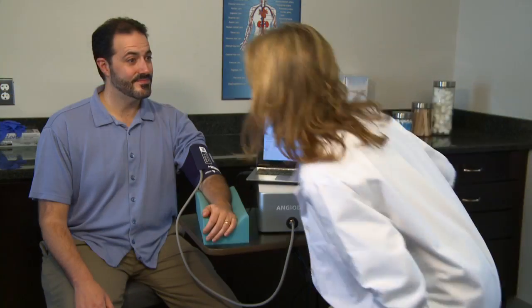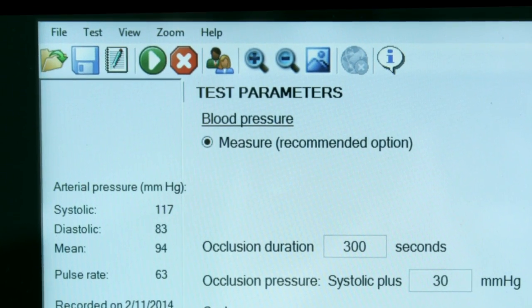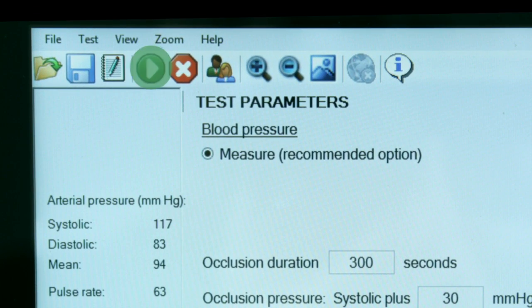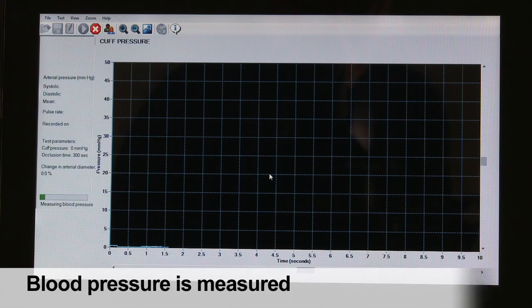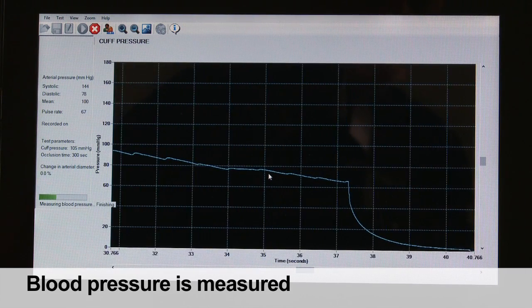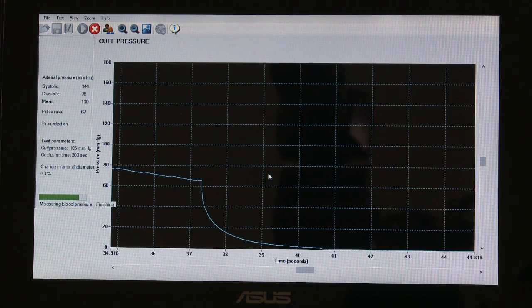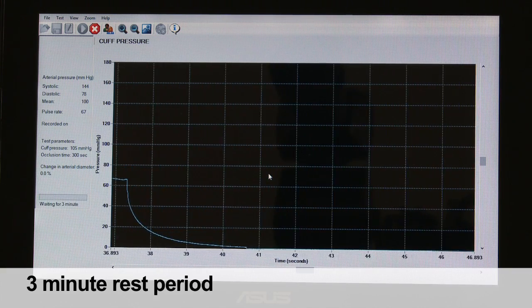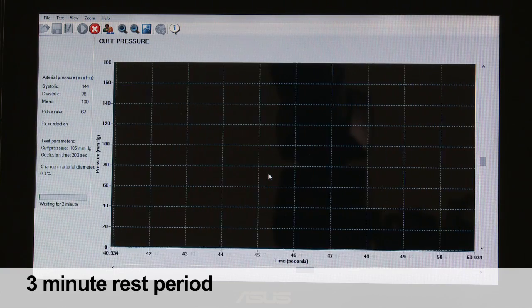After the 10 minute rest period, the testing proceeds as follows. The test is initiated by clicking on the Start button. First the system takes a blood pressure measurement. Blood pressure will then be displayed on the screen shortly after the cuff deflates. The system then provides a 3 minute rest period to allow the patient's arm to return to its rested state.